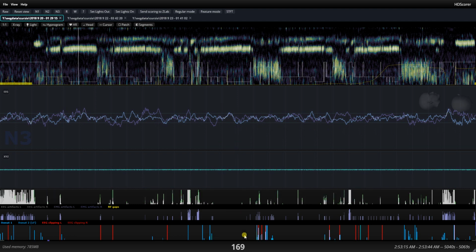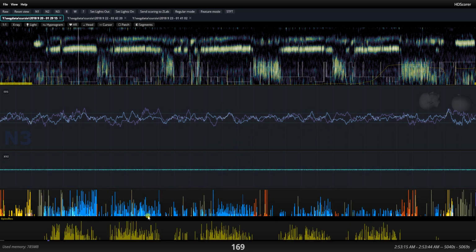So the way I've done this is I departed a little bit from the AASM rules. I'm able to get a complete plot, which is not shown here, of the sleep depth. And then from that sleep depth, I calculate a threshold that is used to mark N2 versus N3, and that threshold is calculated according to the most likely phase change. So I am taking the level of intensity of sleep such that the patient spends the least possible amount of time around that level of intensity.